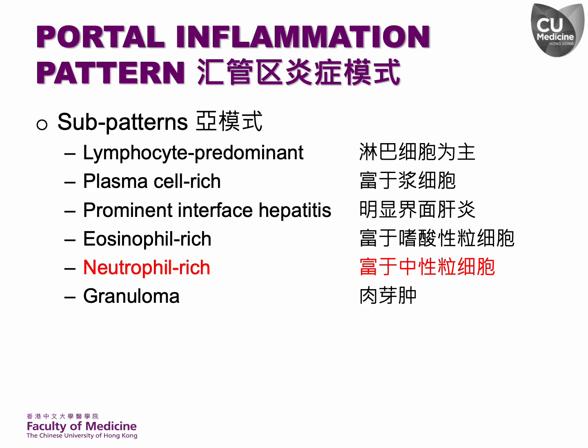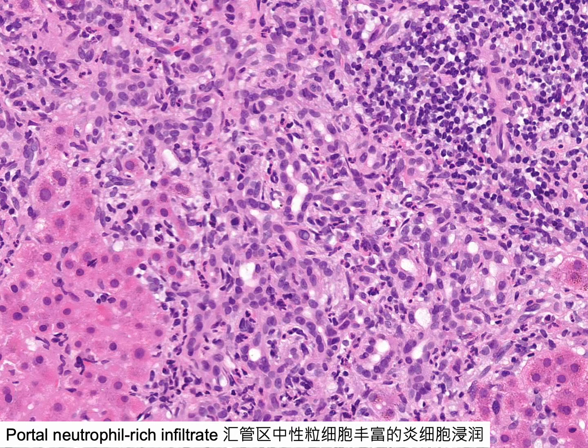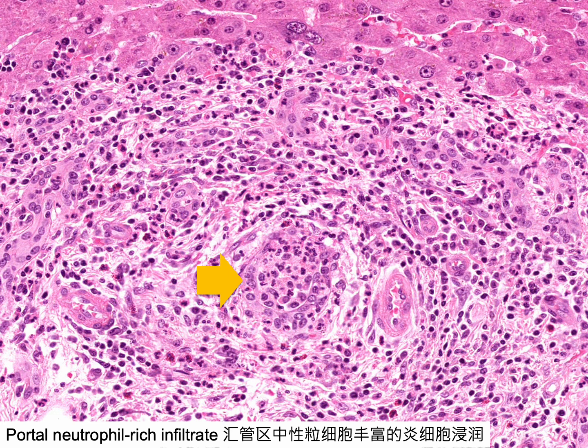Let's move on to discussing neutrophil-rich portal inflammation. A significant number of neutrophils are accompanied by ductular proliferation. This mixed portal inflammation consists of many neutrophils. An interlobular bile duct is infiltrated and distended by neutrophils, indicating acute cholangitis.